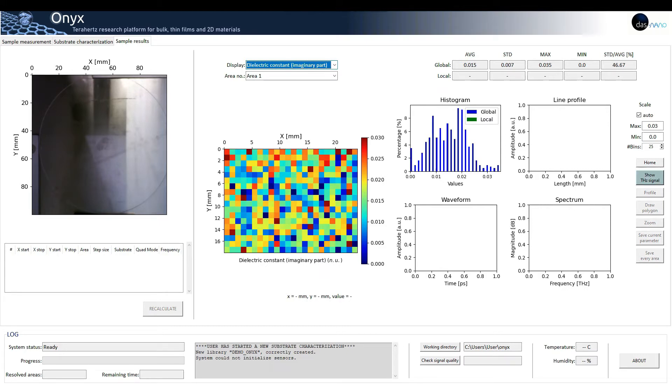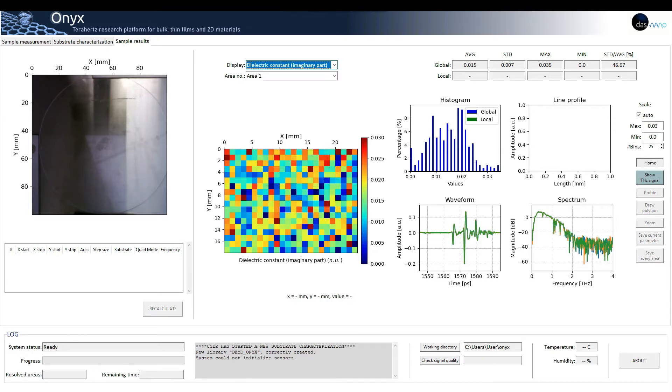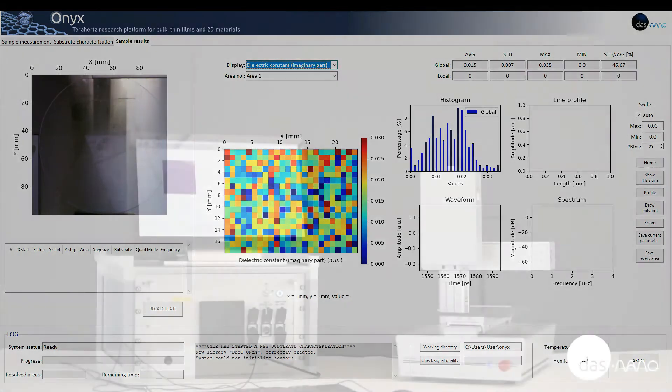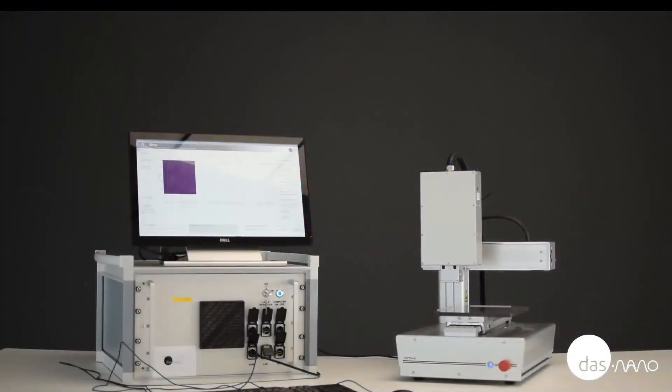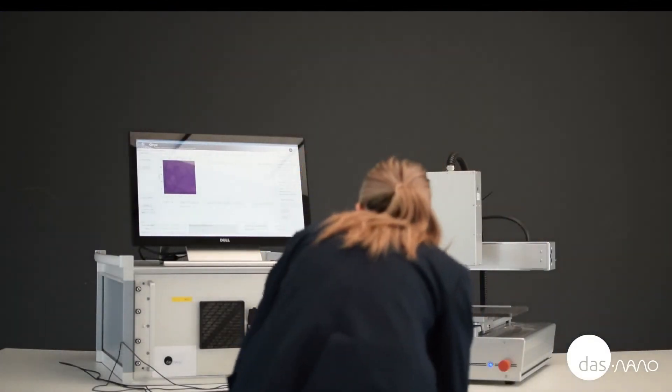As you can see, the software is very intuitive and easy to use. Once our substrate is fully characterized, we will proceed with the measurement of our sample of interest.